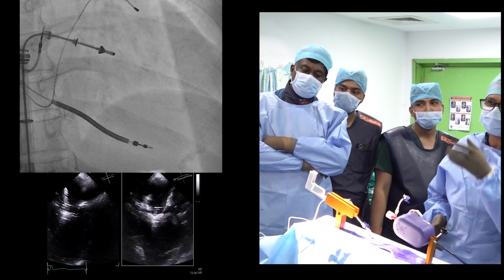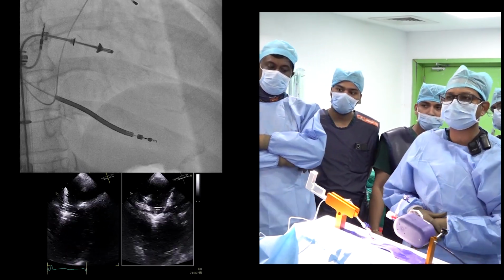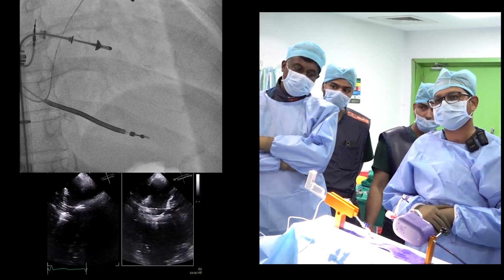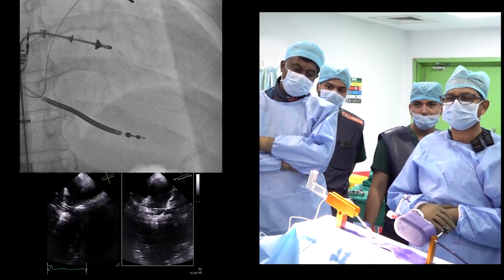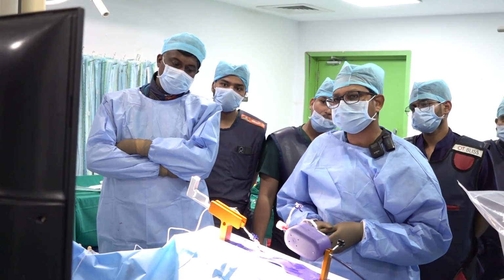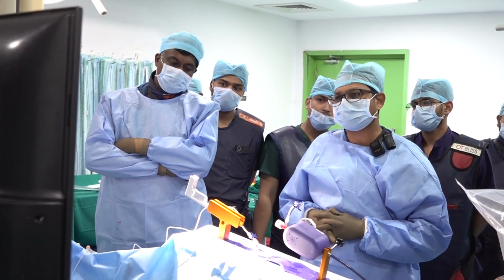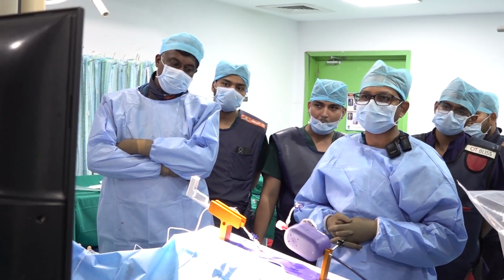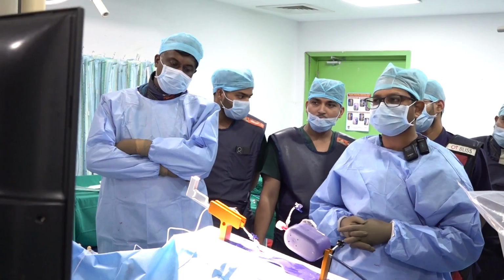You can appreciate here that both leaflets are resting on both arms of the MyClip. The anterior and posterior mitral leaflets are comfortably sitting at this position, which means this position is good. We are good here to lower the grasper of the MyClip. So we lower the grasper of the MyClip.